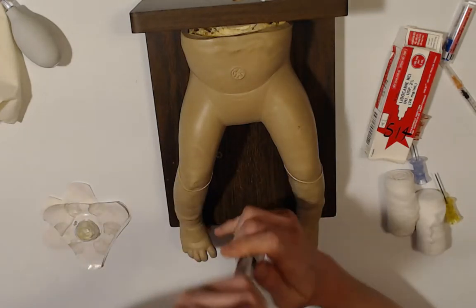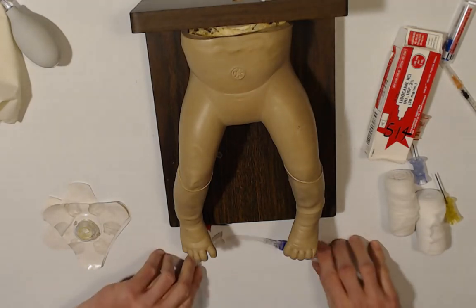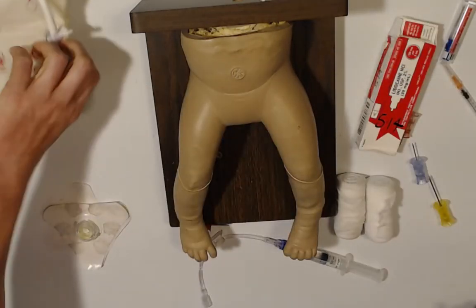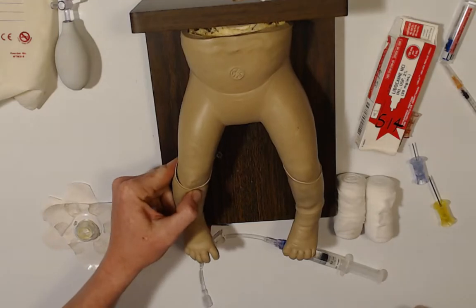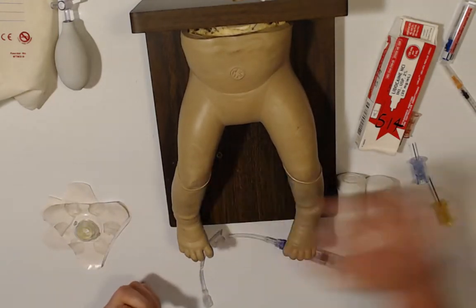Okay, of course I would want to pre-prime my tubing, get all the air out of there. I have something to secure it with. I have my pressure infuser to go on my IV bag. And I would have an alcohol swab, and I would want to clean my site, okay? So let's just go for this proximal tibia. That's what this mannequin's designed for. They don't have a hard bone in the femur.